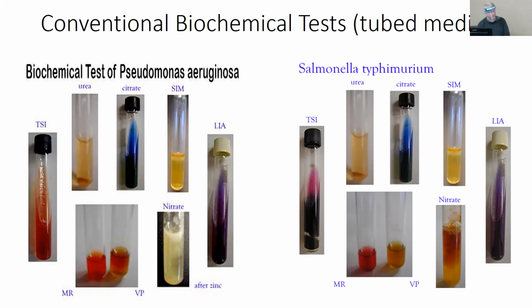All right. So you saw these, but where did you see these? Where did you see citrate turn blue? The API script? Yeah, you had it in the API. So you didn't have the tubes, right? I think y'all did this in micro for health professions. You're taking the change you can see in the tube and converting it into the API strip. We started there more so than a tube. And then we moved to the microscan panels, which we're going to finish up today.